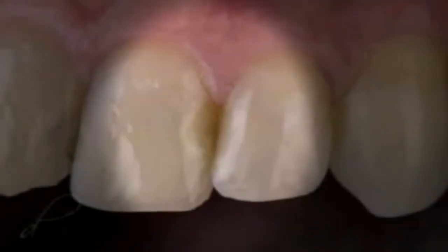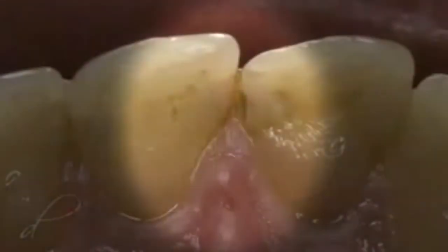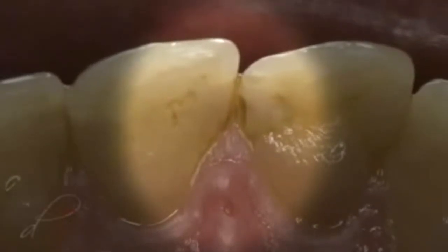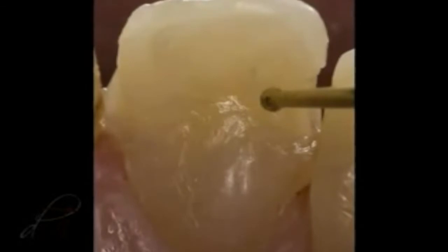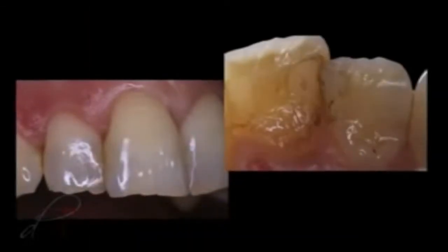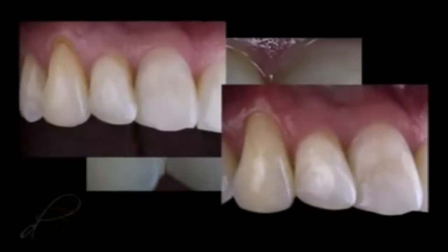Restoring the interproximal zone with composite resin restorations using conventional hybrid composites has always presented challenges. Improper placement of these viscous composite materials can result in gaps, voids, and deficient marginal seal at the restorative interface. However, by utilizing a modified self-etch technique and a simplified placement of a next-generation flowable, an ideal tooth restorative interface can be achieved.